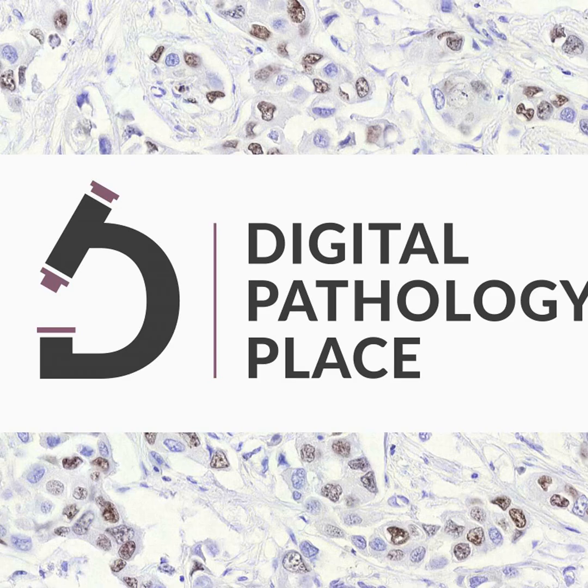12. Computer-aided diagnosis. Computer-aided diagnosis, sometimes referred to as decision support systems, refers to the use of artificial intelligence algorithms to assist medical professionals in detecting and diagnosing diseases. In the context of image analysis, these systems can highlight areas in a tissue image that appear suspicious or that warrant further examination. While they do not replace the pathologist, they significantly streamline the diagnostic process by making it more efficient and accurate. With reliable image analysis tools in place, pathologists can provide more timely and precise diagnosis, thereby enhancing patient care.